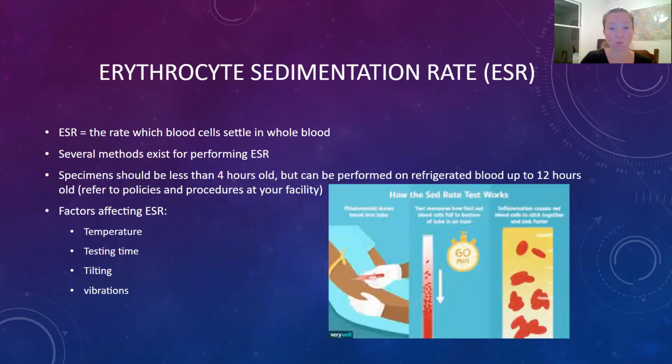So we're going to talk about our waived tests now, and this is what this presentation, of course, is focusing on. These are procedures that the FDA has cleared for use, whether it be in the home or in the laboratory. They're simple to use, they're easy to interpret, and they produce accurate results. These tests don't require much training. Various tests have been continued, as we mentioned a second ago, and we continue to develop more that are waived. Each test, like I said, is going to come with specific instructions from the manufacturer.